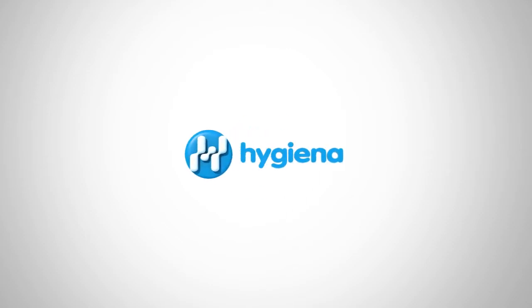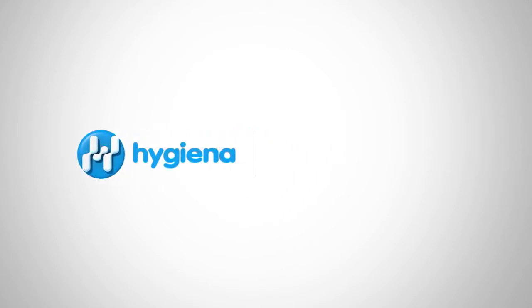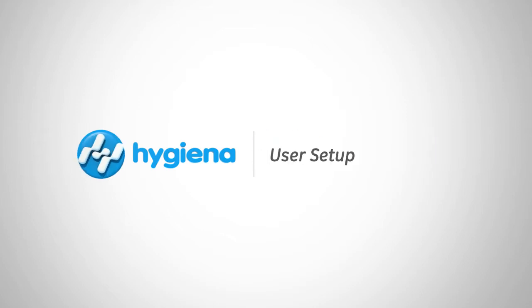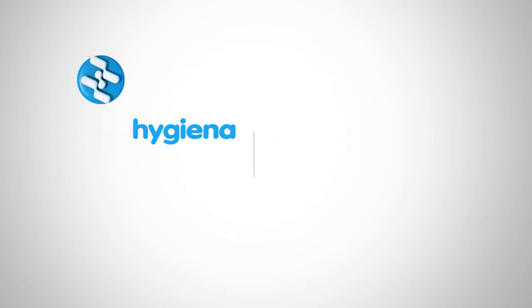Welcome to the SureTrend 4 instructional video series for Healthcare. In this video, we'll cover adding users. Let's get started.